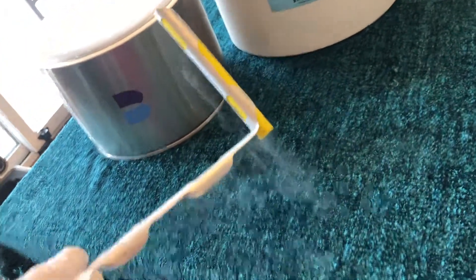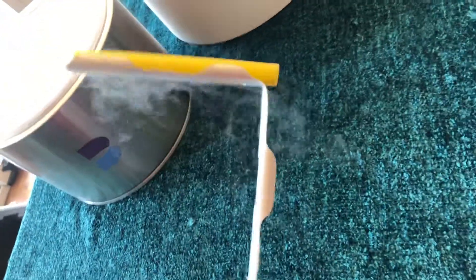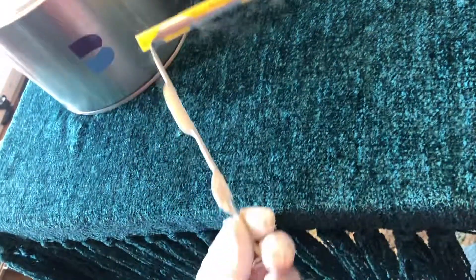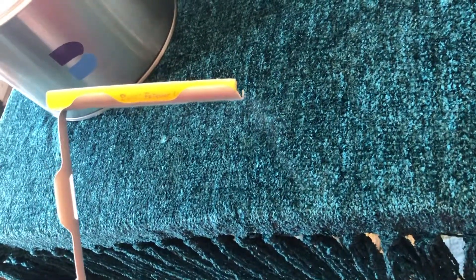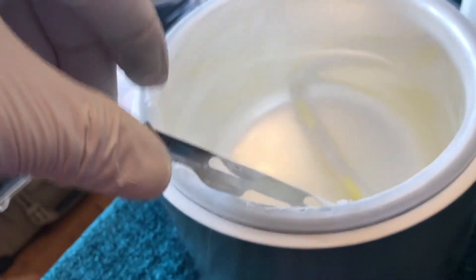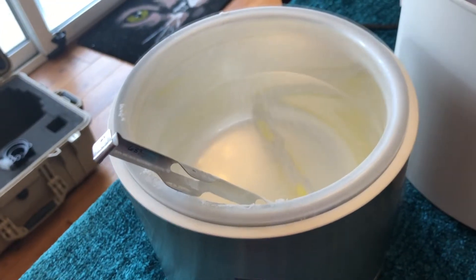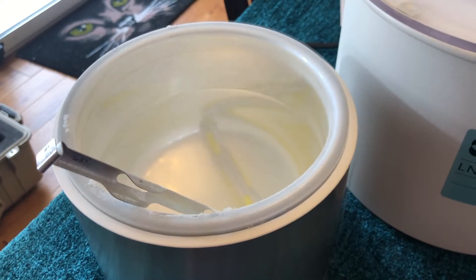This little gadget is key to our process today. It's actually just a standard straight aluminum cane meant to hold goblets — this is a 13mm diameter goblet that holds about 20 ml of liquid nitrogen. I bend it at 90 degrees and use it as a dipper to go into this insulated reservoir of liquid nitrogen. That's going to be our transport system to introduce nitrogen into the central core as we're doing the very brief semen freeze programs, which typically last less than eight minutes — so it's not like you have to sit here all day adding nitrogen.